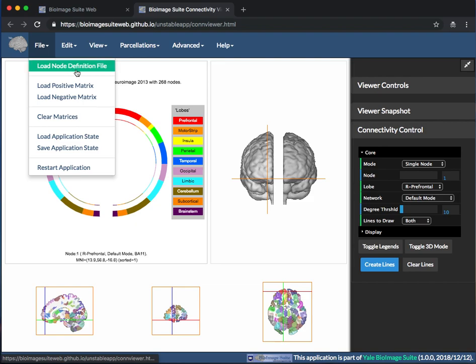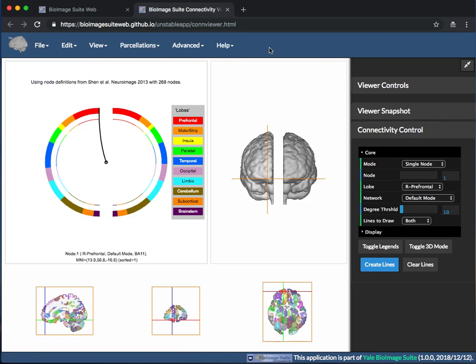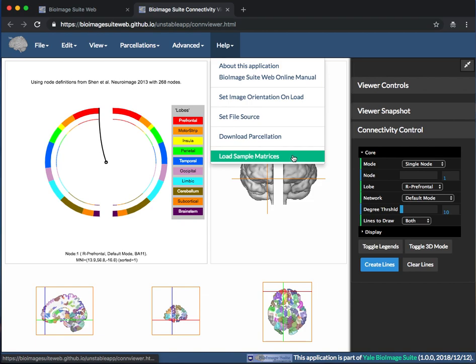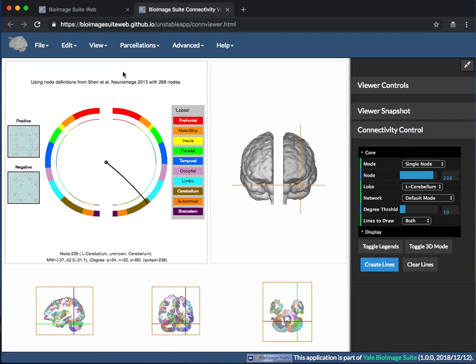you can load them into the Viewer by going to File, Load Positive Matrix, and optionally File, Load Negative Matrix. You can also load some sample matrices by going to Help, Load Sample Matrices, which are defined in the Shen atlas.